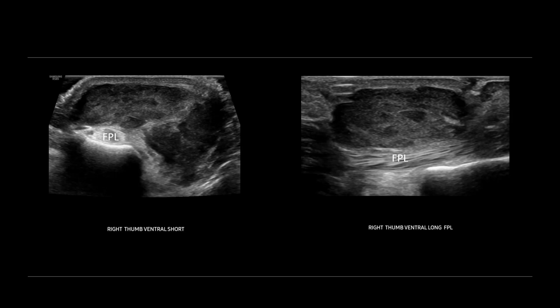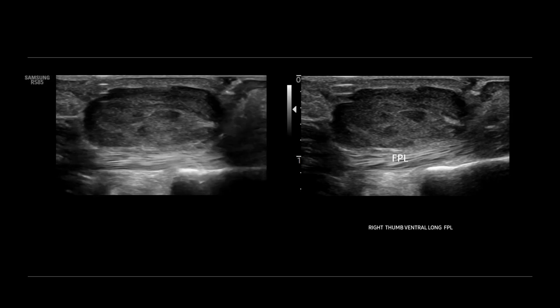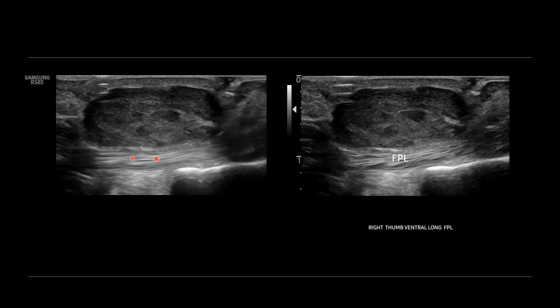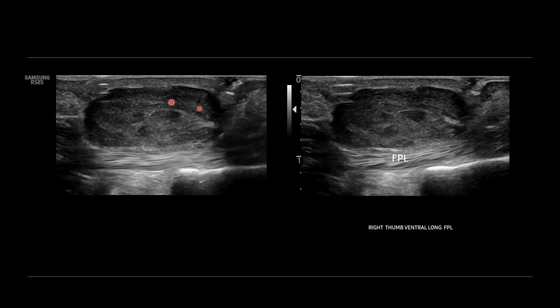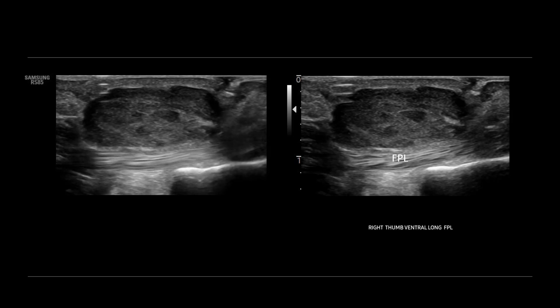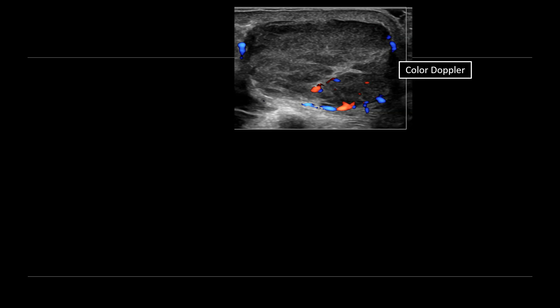Whenever you have a mass abutting a tendon, you want to evaluate dynamically to see how that impacts tendon movement. So here we're having the patient flex the thumb. You can see that the tendon is gliding smoothly between the mass and that proximal phalanx, but the mass is not moving with the flexion — it seems separate from the actual tendon. Let's add color Doppler and note that there is increased vascular flow within the mass, confirming that it is indeed a solid mass.